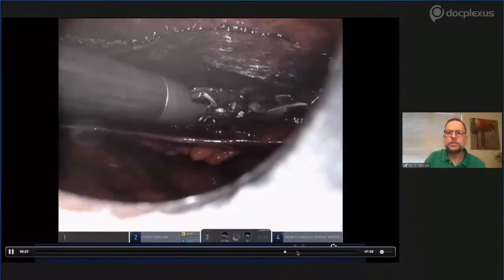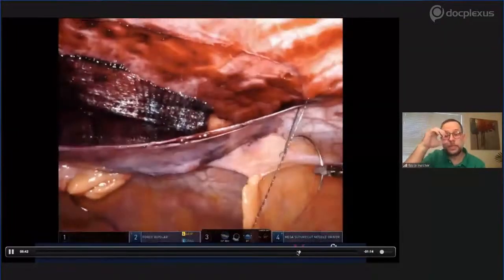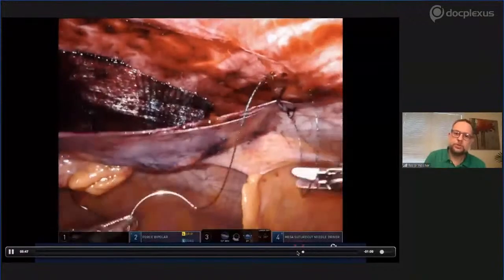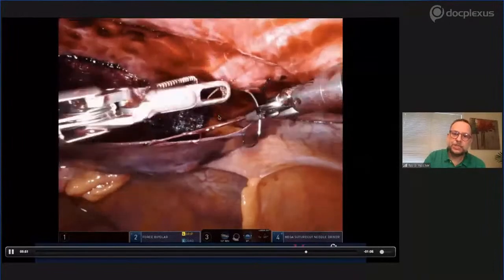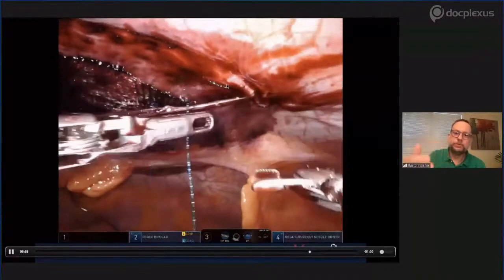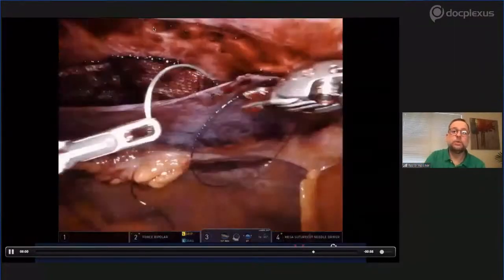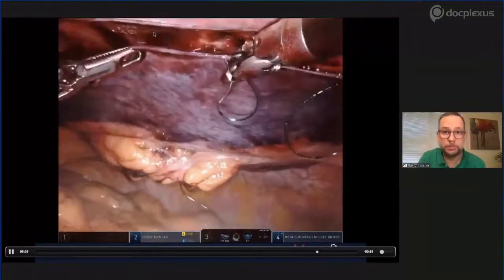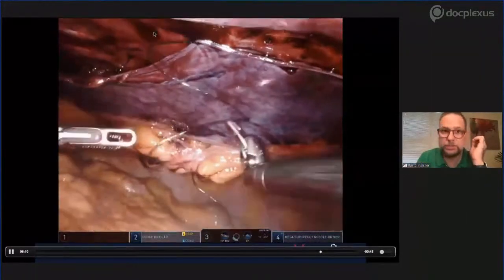And at the end, you just need to close your peritoneum. For me, when I try to do this by laparoscopy, this is the most difficult step. And I just want to stress to you here, there are 2 options. You don't need to close the edge with the edge. You just need to close the space. So you can do it before the edge to avoid tension, or if your mesh is a little bit over the edge, you can suture the inferior lip to the upper lip. There's no issue. You don't need to do edge to edge. Just be cautious of that.